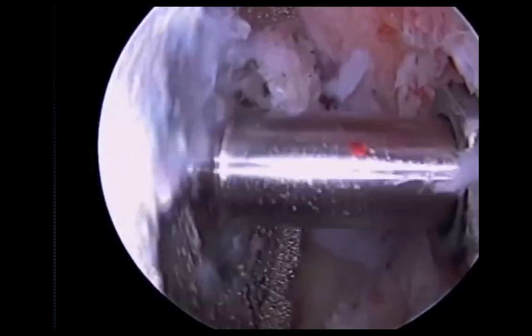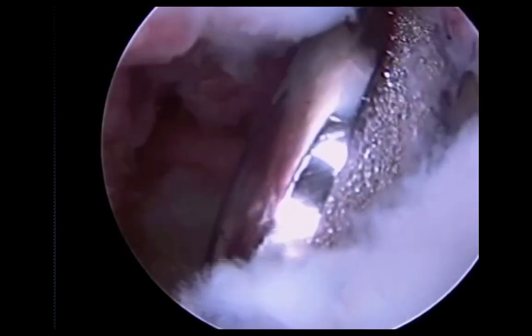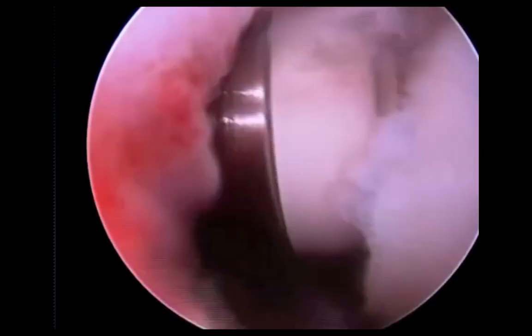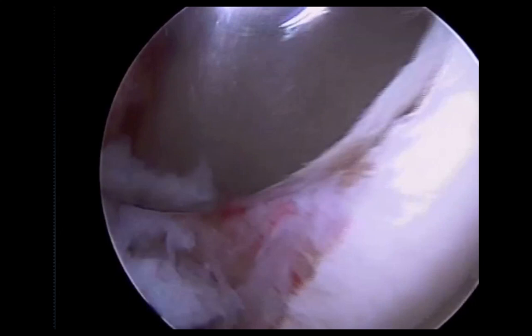Before the HemiCAP implant is inserted. This is securely impacted into place. We now visualise the HemiCAP through a posterior portal. We then go on to perform a fairly standard Bankart repair, and in this patient, a biceps tenodesis.